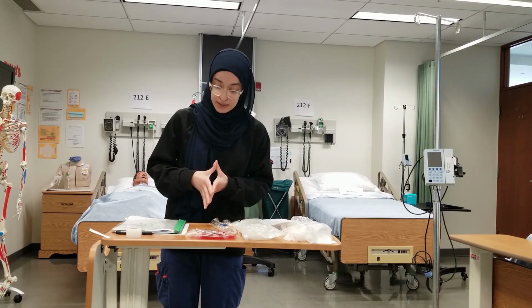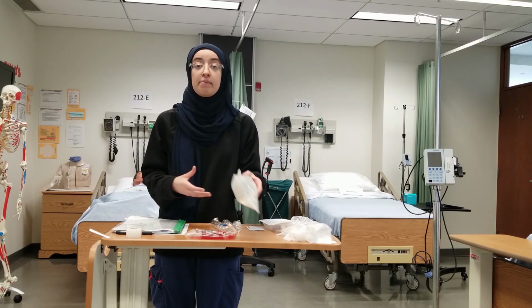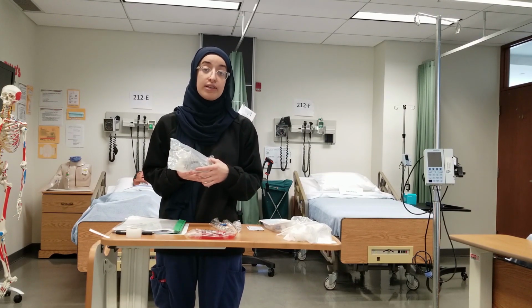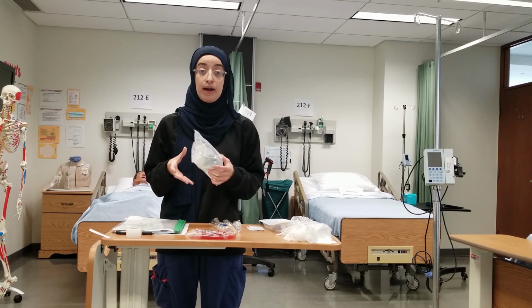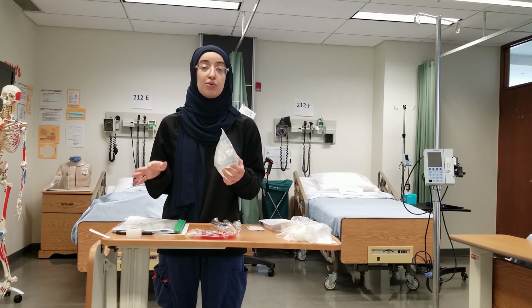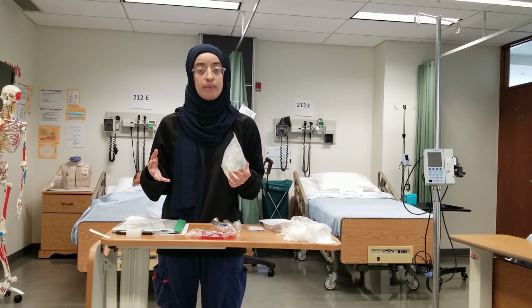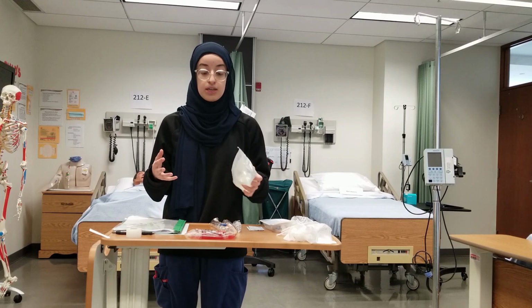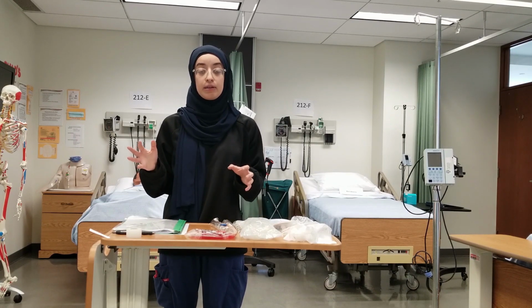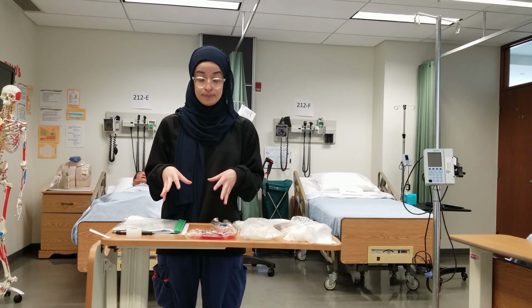In terms of solutions that we use, typically normal saline is the only solution that is compatible with blood products. There is mixed evidence that lactated Ringer's can be used, but you want to steer clear of that just in case there is a reaction between the two solutions. You can always check an IV compatibility chart at your agency to check what your agency standards are.